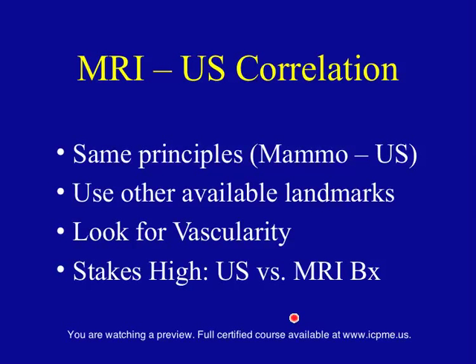The other thing I like to do is look for vascularity of a correlating lesion. I find more often than not that ultrasound correlates of enhancing masses on MRI tend to have some vascularity.